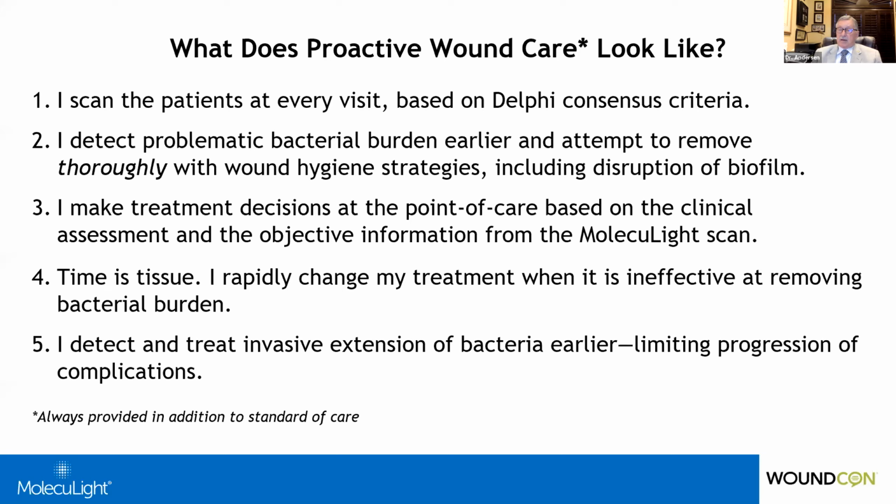In addition to that, if there's no wound and a patient just comes in with cellulitis, cellulitis alone many times is not picked up with the MolecuLight. It's when that bacteria extends out from the margins of a wound that you're able to see it with the MolecuLight. So very important, as you say, that this is part of the total package of standard of care and standard assessment. It's not an isolated decision-making tool.